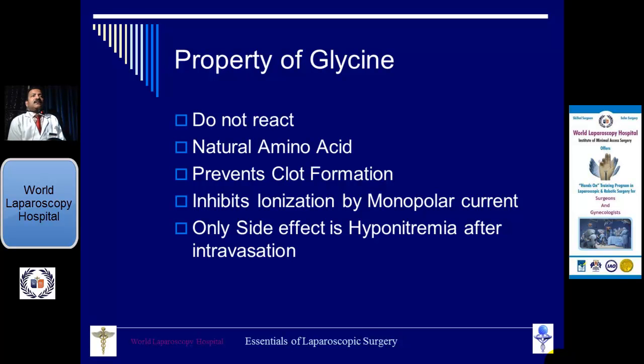First, time of surgery. It should not be prolonged for more than 1 hour in one go. Suppose you have a very big submucous myoma, and you could not do it immediately, then never mind, do it next day. But don't try to continue for a long session at one time. Next day means after 2 weeks, 3 weeks, not the very next day.